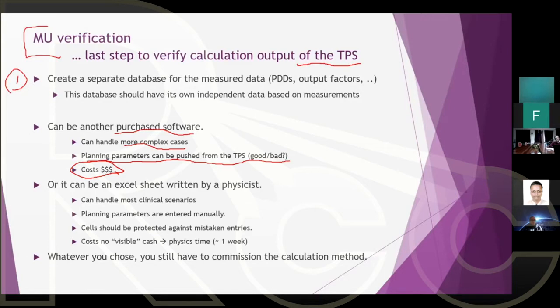Electron, if you guys do electron very often, or you think you do very complicated electron cases, you might not need it, honestly, the electron check. So vendors will always try to send you a complete package with everything, or as much as everything as possible. You try to negotiate with them and take down to the least that you need.